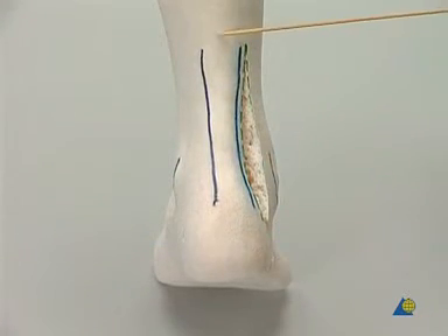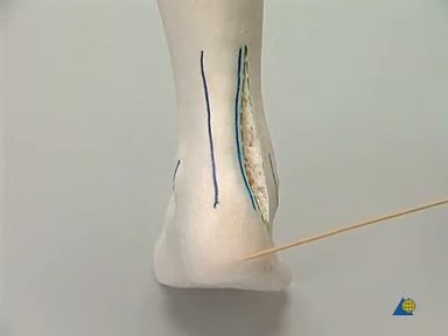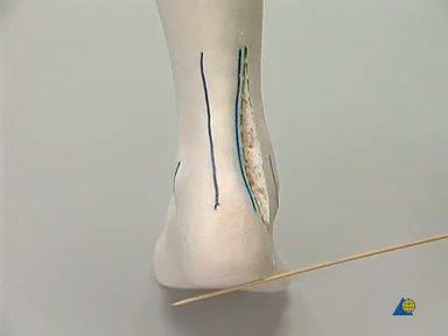Finally, the correct orientation of the foot is confirmed. The axis of the leg is in valgus relative to the orientation of the heel.